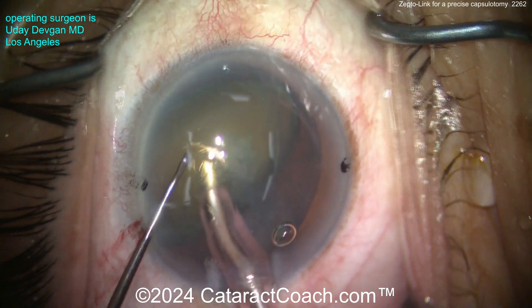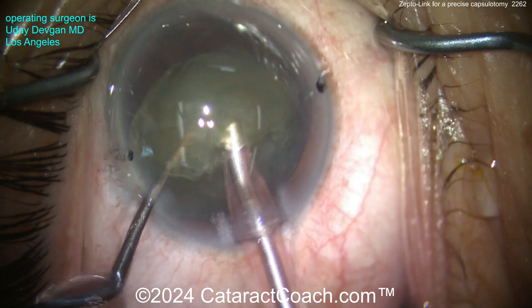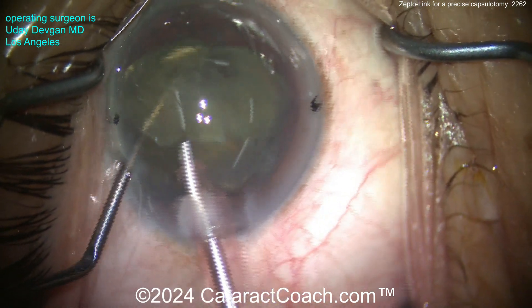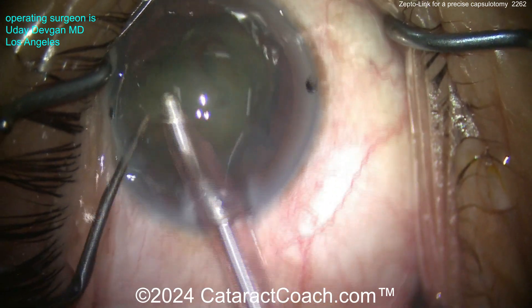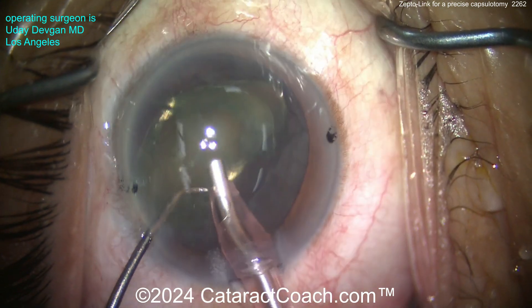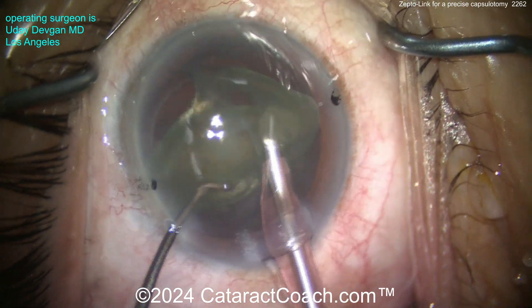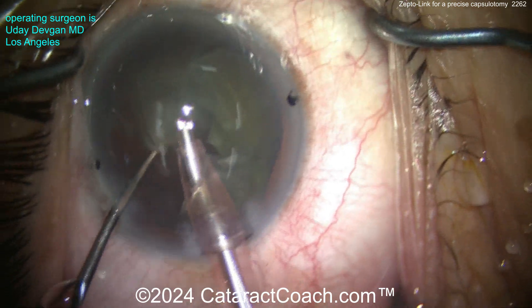Here's a chop — boom, two halves created. Emulsify each half and done. I love this device; it is fantastic. I think you will find many uses for it in your own operating room — like in an intumescent white cataract, I cannot think of a better device.